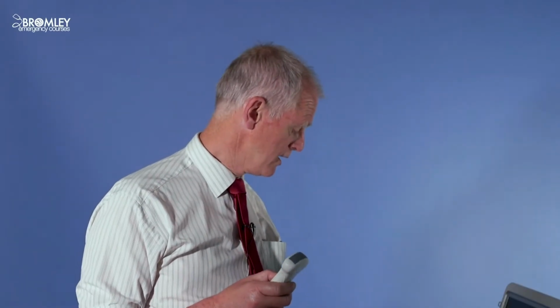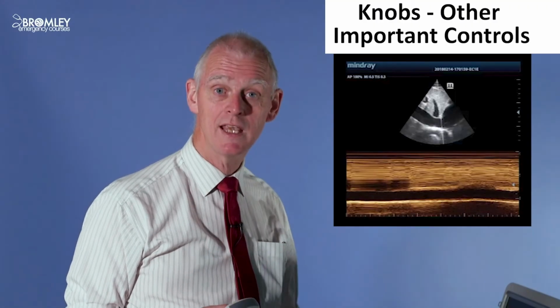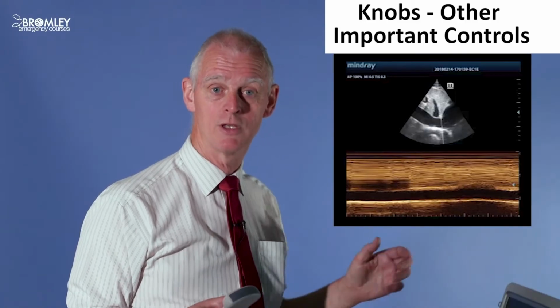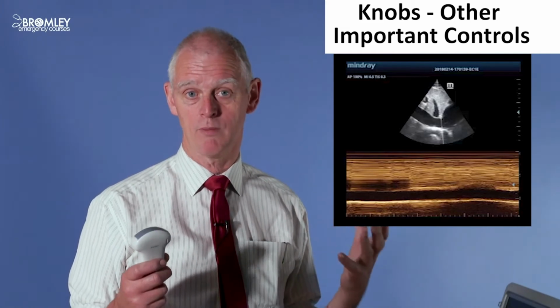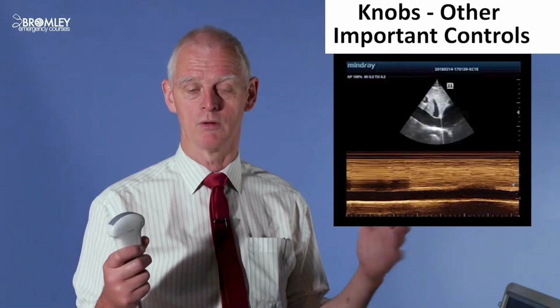I'm going to put something up so you can see here that at the top, this triangular image is a two-dimensional image. And this is made up of these three bits of information. You can almost think of it like pixels, like in a digital photo.